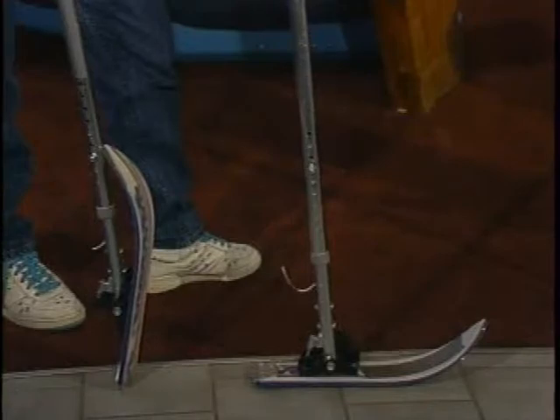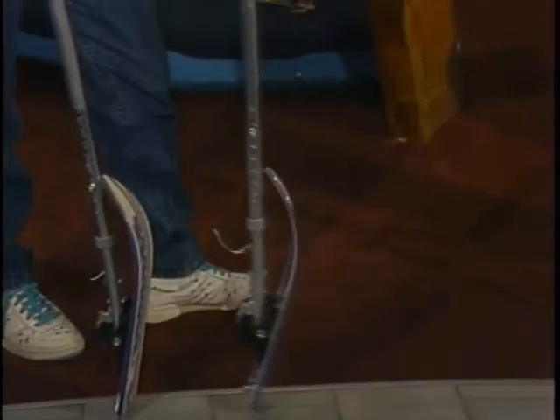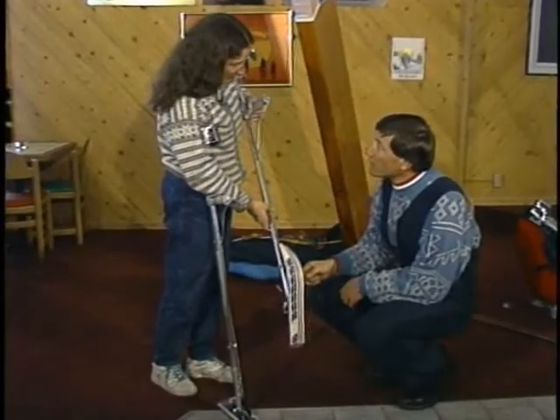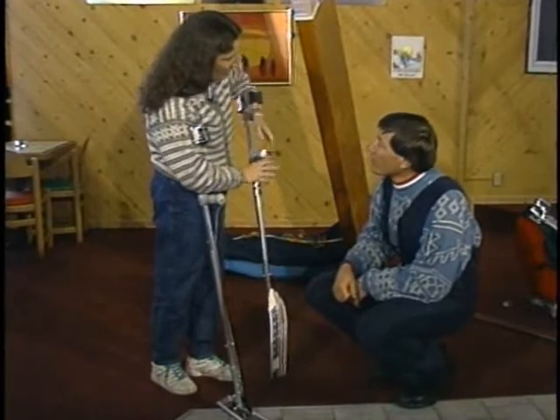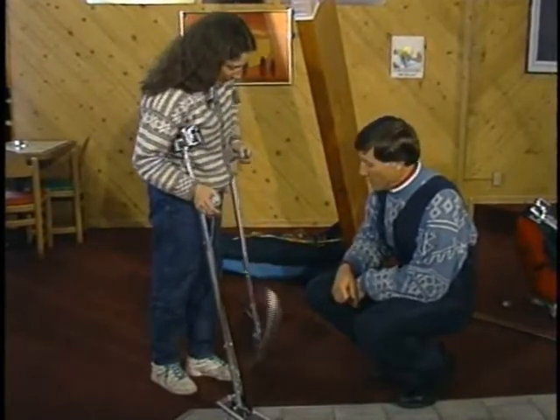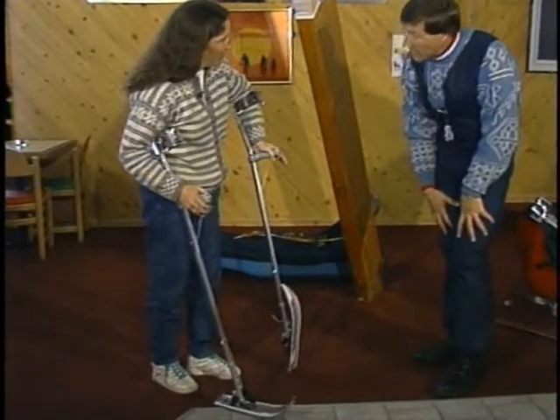The ski tip at the base of the outrigger is stationary until the string is pulled. Then it flips up. This is what we call the walking position of the outriggers. When you're out on the snow as a beginning skier, many times they don't have the ability to use the outrigger down, pushing this way. So they pop them up. Therefore, then they've got them to push themselves along in the lift line or to get to the lift line, various things like that.